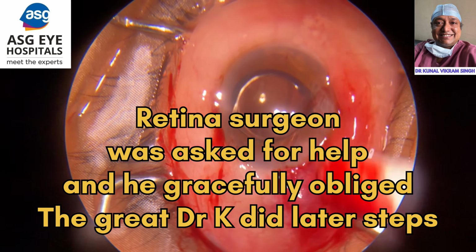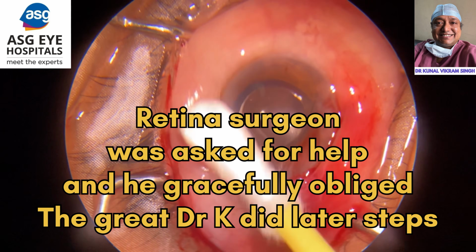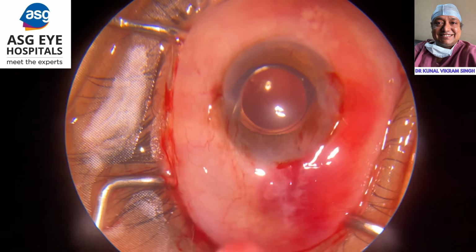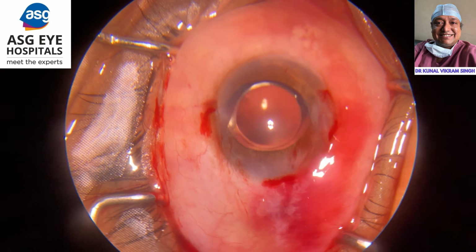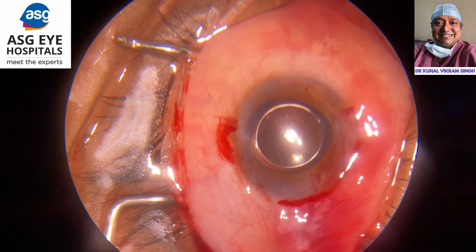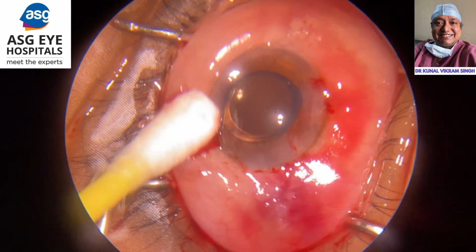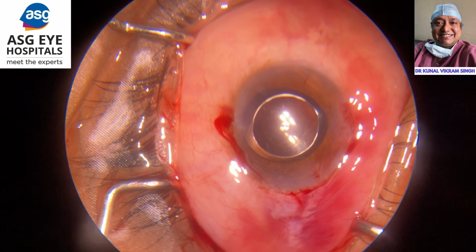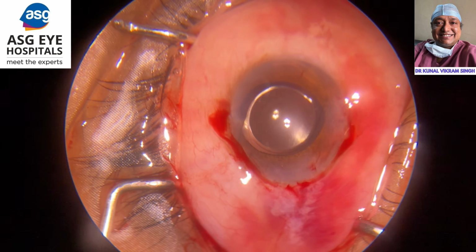Third option, in case it is possible, is that we should take help of retina colleagues, who can do anterior vitrectomy using a trocar cannula, which can be 23 or 25 gauge. Because it was a single eye case and the help was available, I asked for it, and the retina surgeon, Dr. Karthike, gracefully obliged.